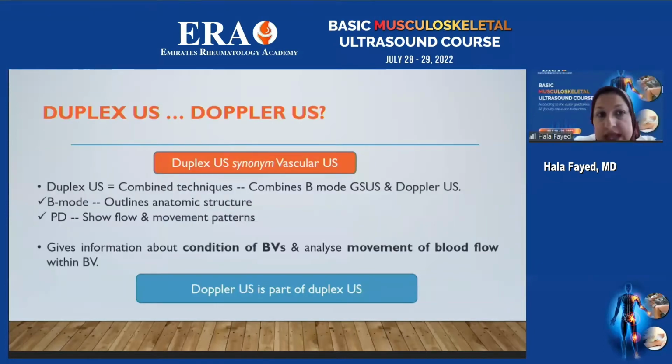And here is, as we mentioned, the duplex ultrasound, because some people get confused between the terms. The duplex ultrasound is a combined technique using both B-mode grayscale ultrasound and Doppler ultrasound, where B-mode outlines the anatomic structure and the power Doppler shows the flow and movement patterns. So it gives information not only about the lumen and movement of the blood flow, but also about the condition of the blood vessel.